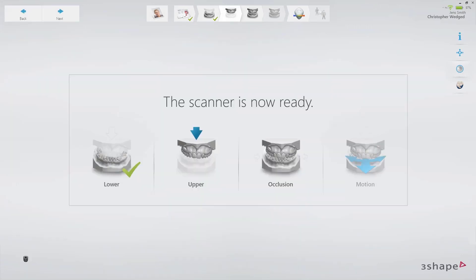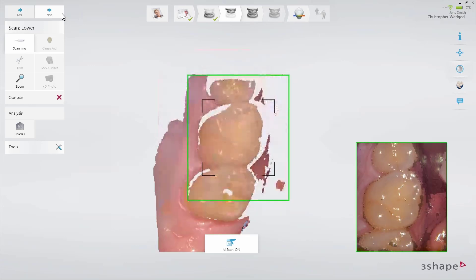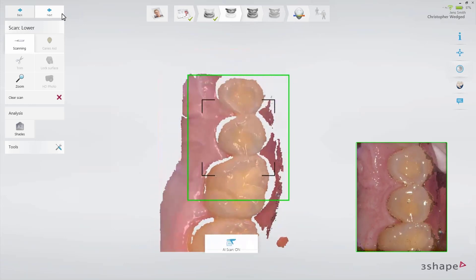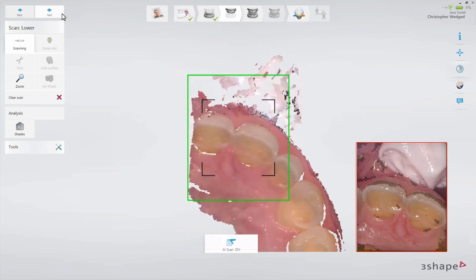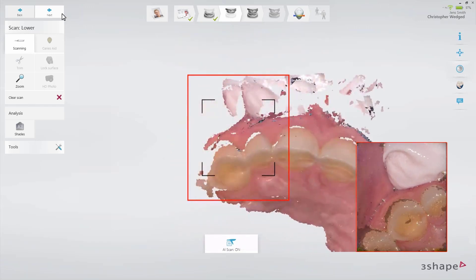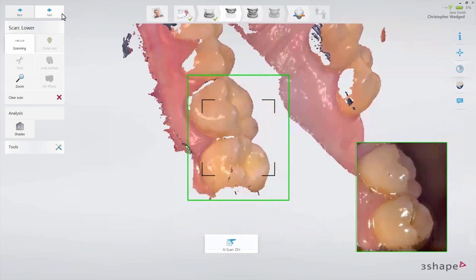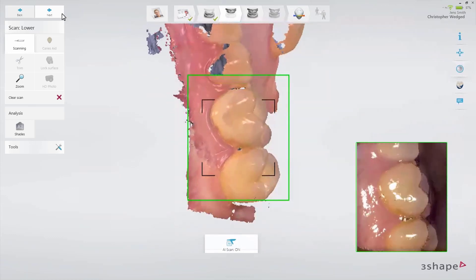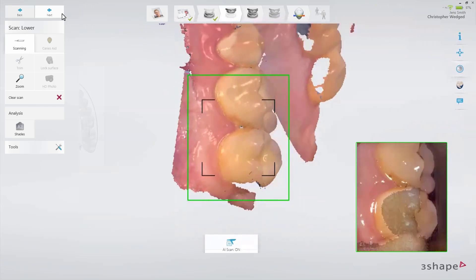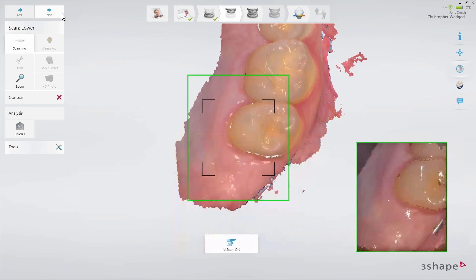Move to the upper jaw and scan it following the 3Shape Scan strategy. Start scanning from the occlusal surface of the molar to the canine. Slowly wiggle the scanner while passing the centrals and continue scanning the occlusal surface on the other side. Roll over the last molar and scan the buccal side until you reach the last molar on the opposite side.